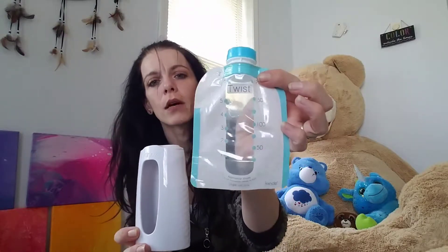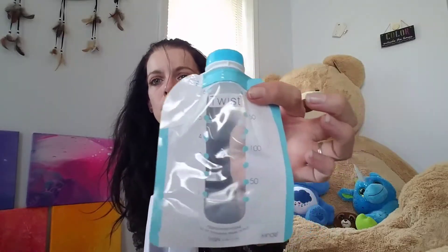This is what you would put your pouch in — this is the pouch. They are six-ounce pouches and they just go up in here, snap into there, and you've got this here.